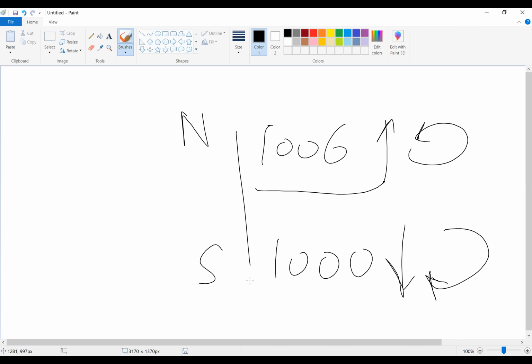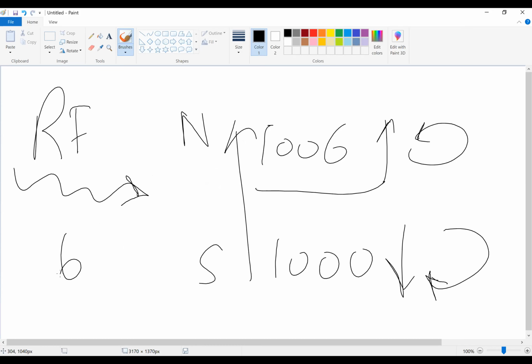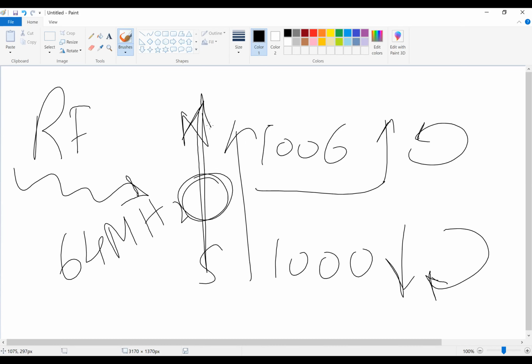So in the direction of the head of the body, there are 6 more protons every million in this direction. So what we do is we put in an RF signal, a radio frequency signal, which should resonate with the proton signal, usually around 64 megahertz. So if the axis is like this, it will get tilted like this. And we know the computer on the MRI machine tells us what angle it's going to flip.